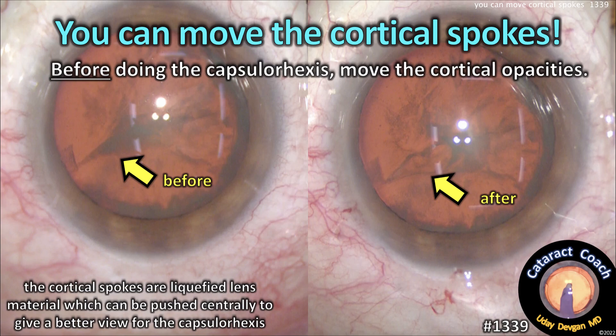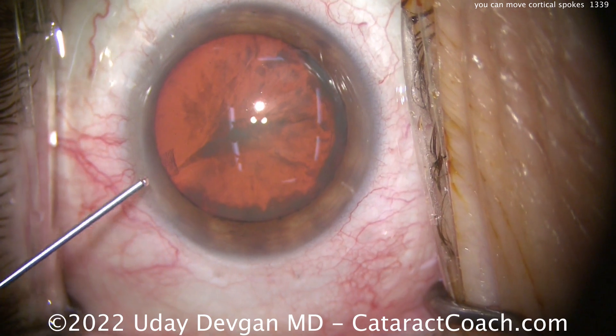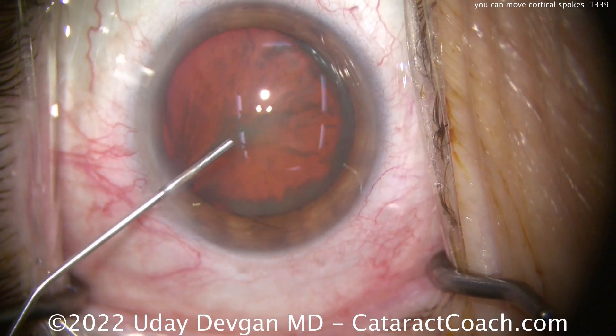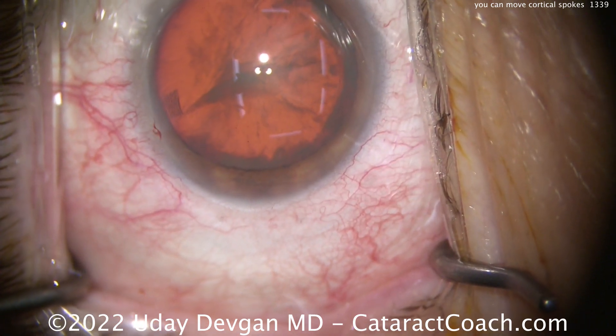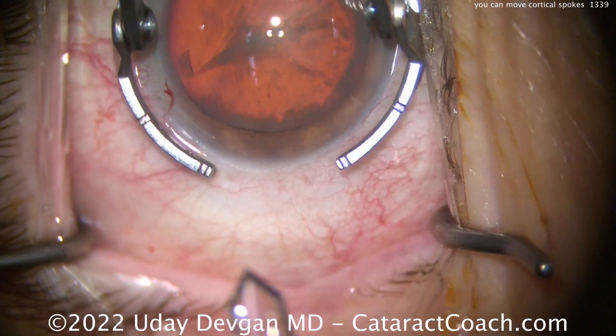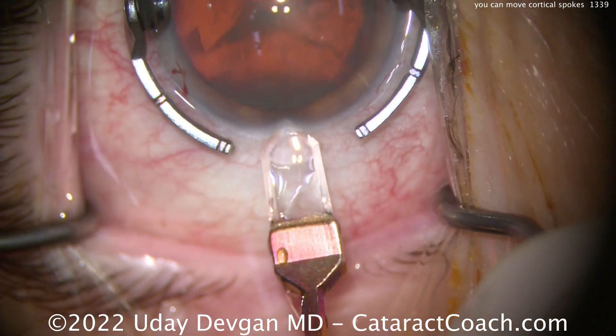You can move the cortical spokes. So before doing your capsulorexis, just move these opacities out of the way. These cortical spokes are usually liquefied lens cortex. And those lens proteins, because they're liquefied, you can push them out of your way. But the best time to do it is prior to starting your capsulorexis.